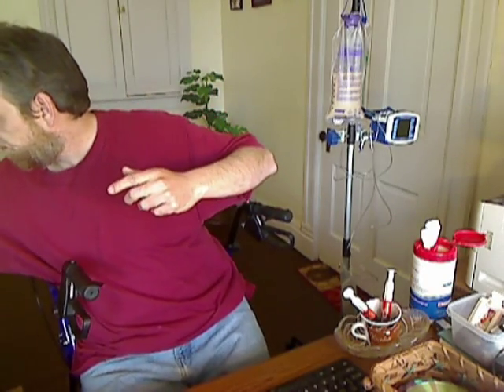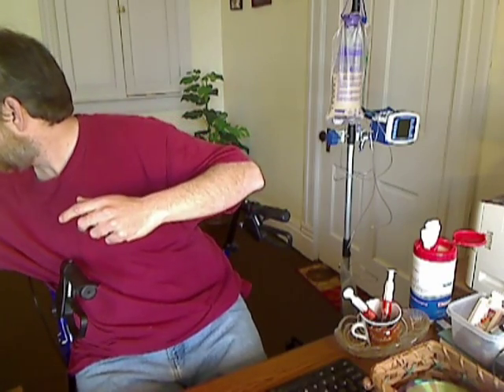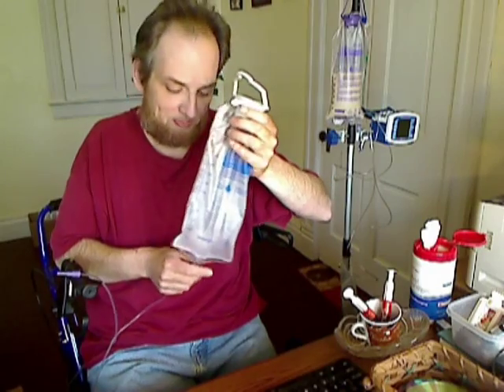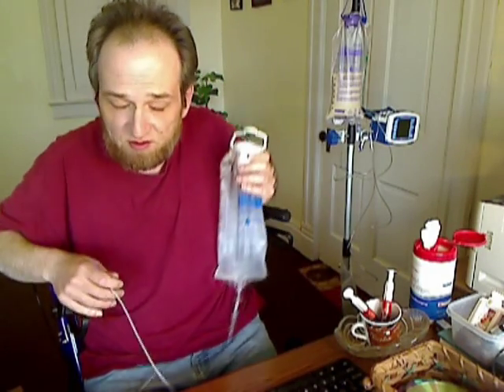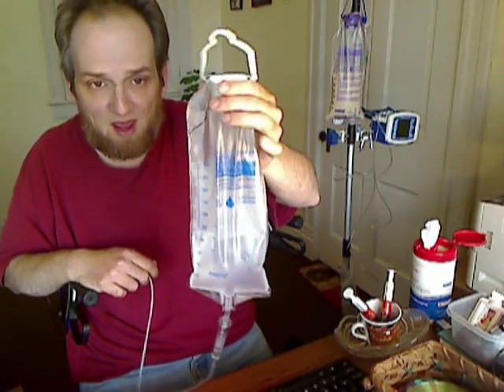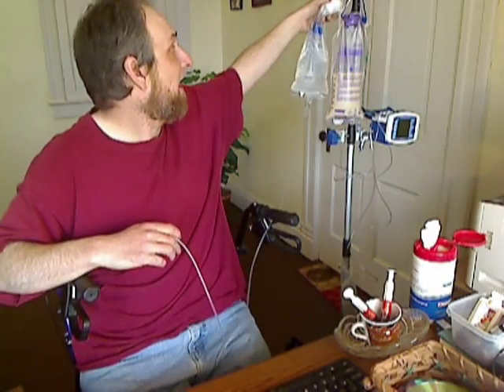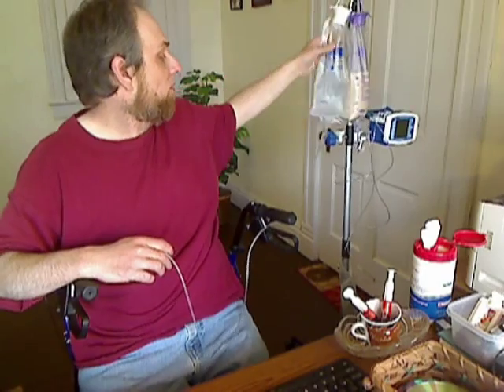And what I do is I take just a regular gravity bag, and I have my distilled water in that. You can do it this way if you have a PEG tube or the button, the Mickey button like I have. It doesn't matter. If you have a feeding tube, you can use your gravity bag to give yourself your medicine. An easy way if you want to try to stay independent. So I'm just going to hang my bag up here on my pole.